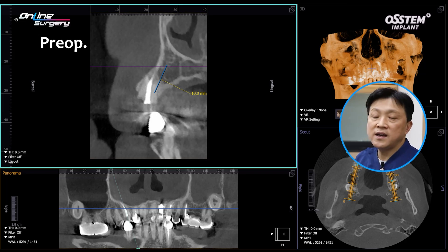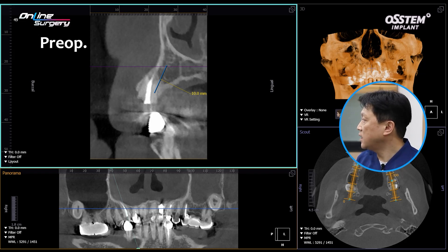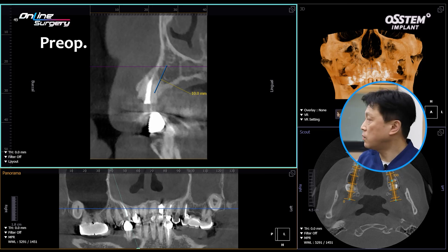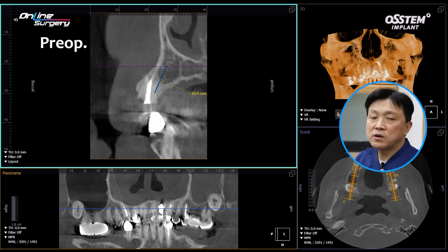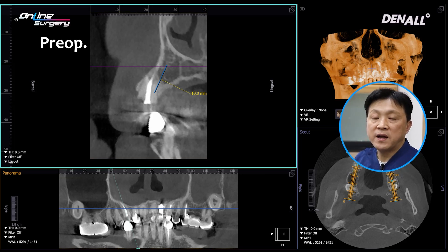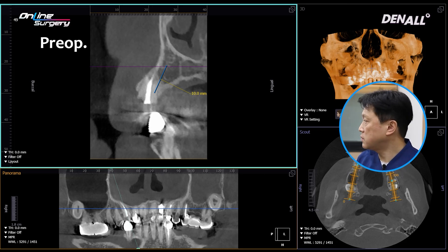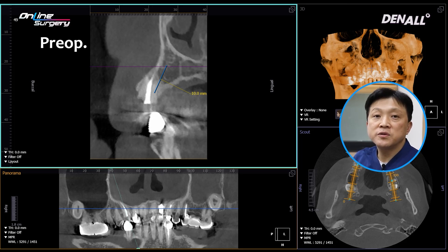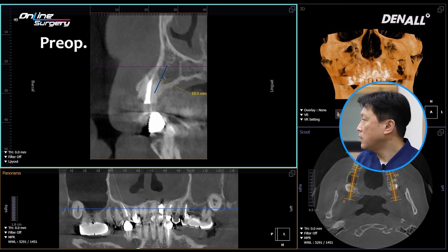In the case of this patient, a surgical guide would be used to place the implant in the accurate direction. The preference is not to open the flap and to place the implant immediately after extraction. For the gap and soft tissue area, a dual zone graft would be used. That was the plan.